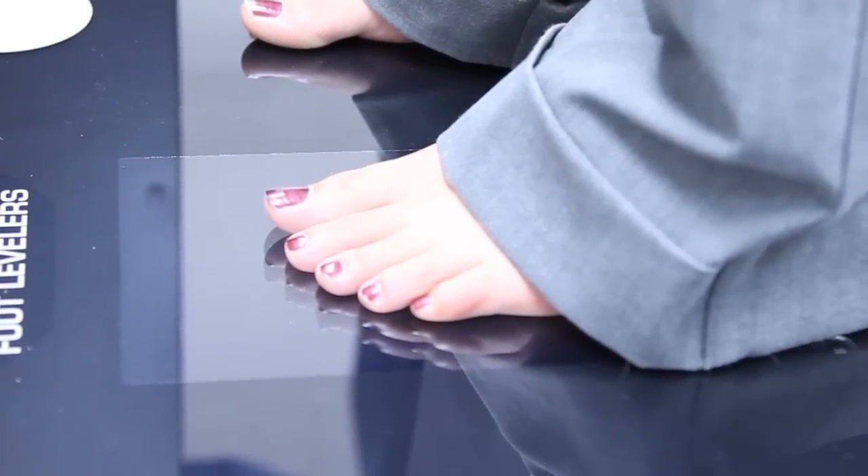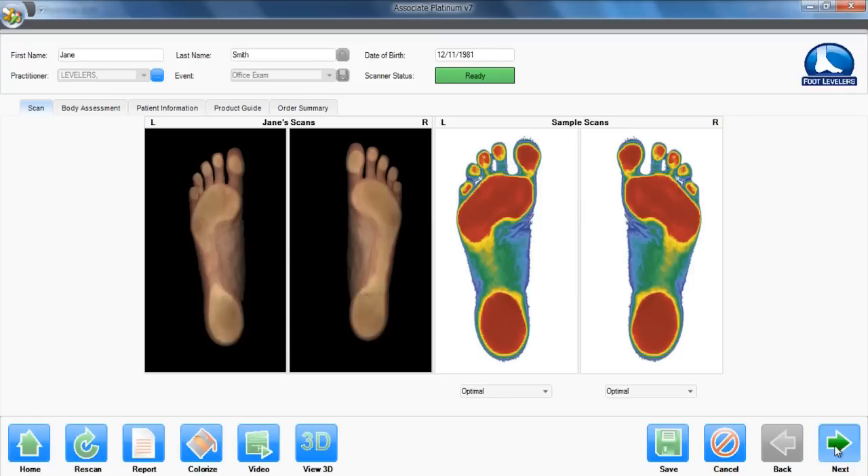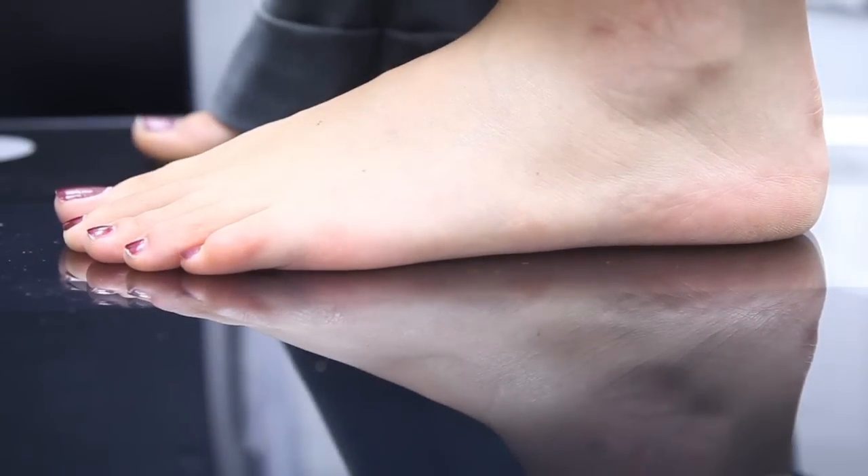After each new patient has been screened, the system delivers a highly detailed view of the left and right feet in true color. The colorized image shows the height of the arches. The accuracy of this new height mapping is within 300 microns, or the width of two hairs.